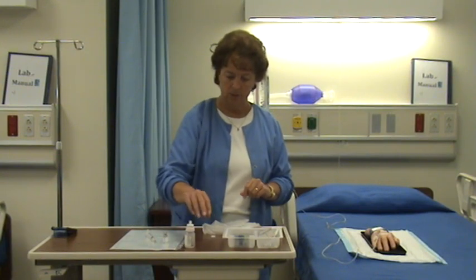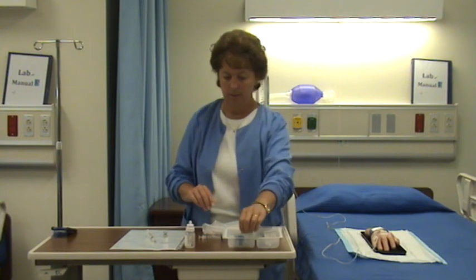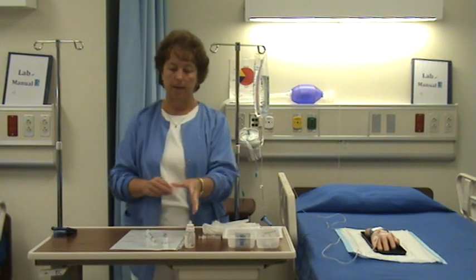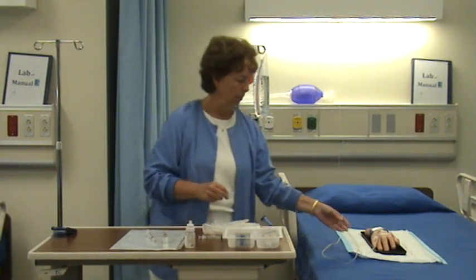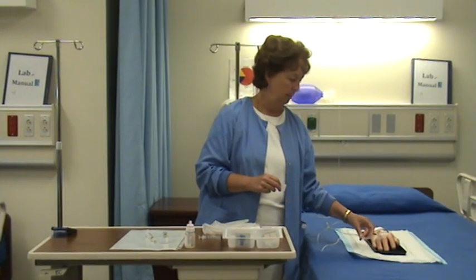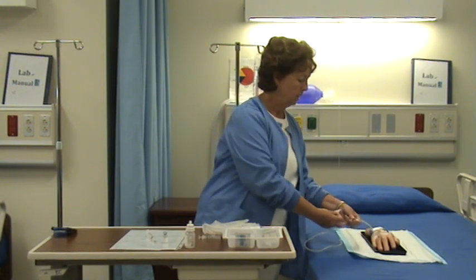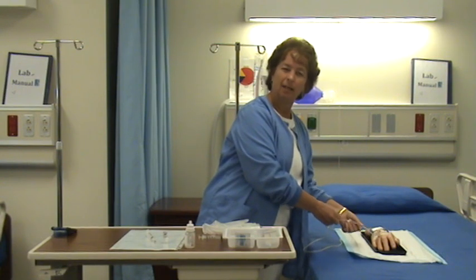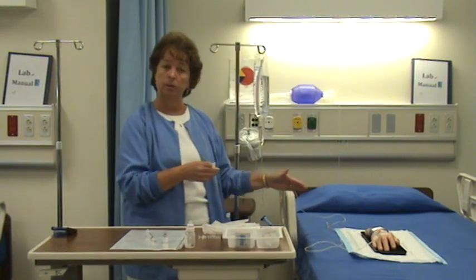And I'm also going to draw up some saline flush. Now, because the running IV is compatible with the medication, technically I don't need a pre-flush or a post-flush. But because I'm giving it right here at this injection port, which is closest to the running IV site, I like to just post-flush, just to make sure that you're present while the complete medication is in there. Because when you give that Lasix, it's basically going to be sitting in that tube. So you can use a post-flush, or you can also let the IV flush that.